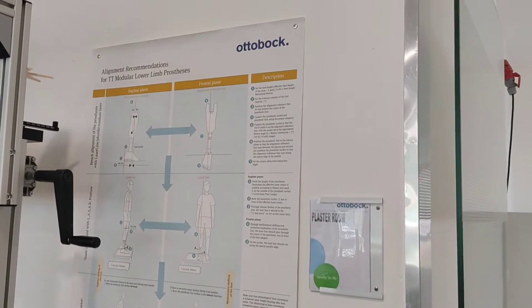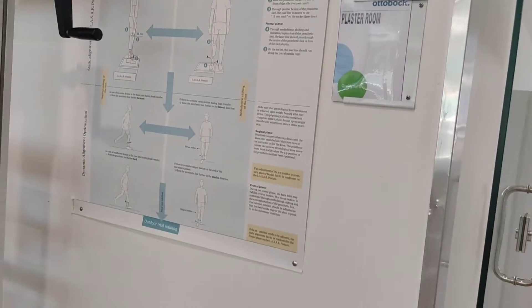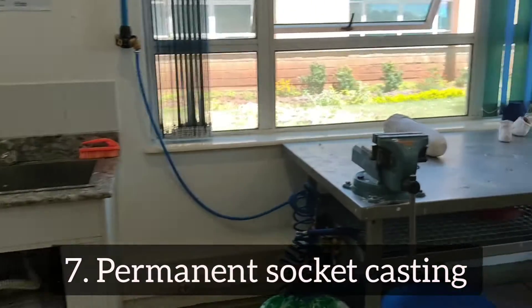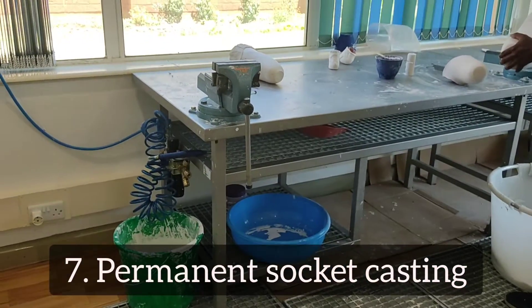Now my physical therapy is done. It's time for them to start working on my permanent prosthesis. The permanent prosthesis is made from the cast of the temporary prosthesis, so you don't have to start measuring all over again — they only transfer all the measurements of the test socket into your permanent socket.